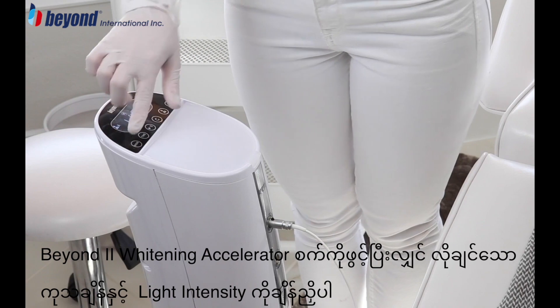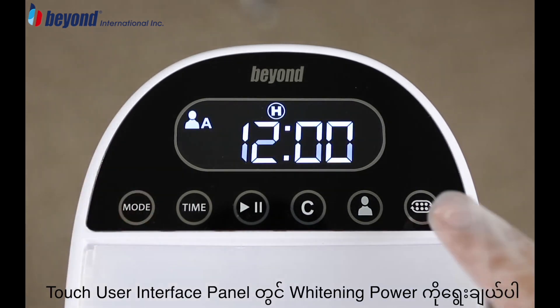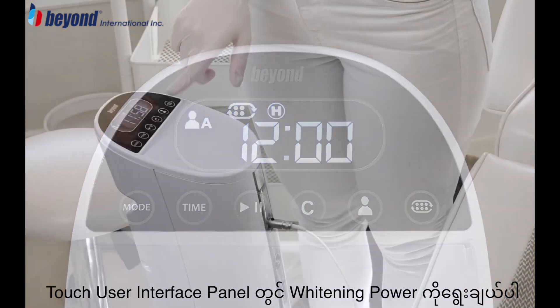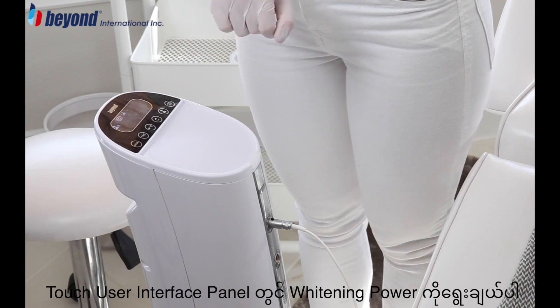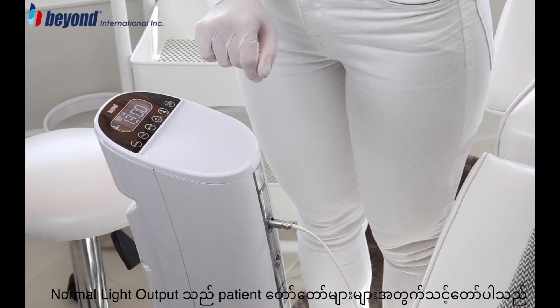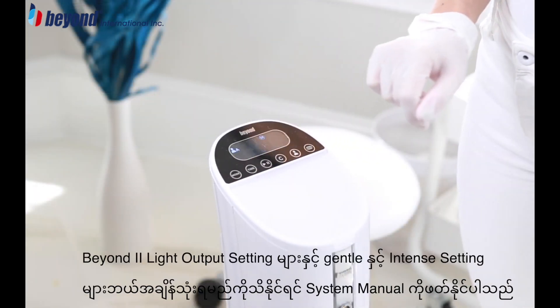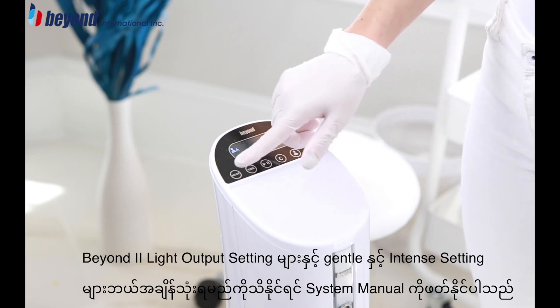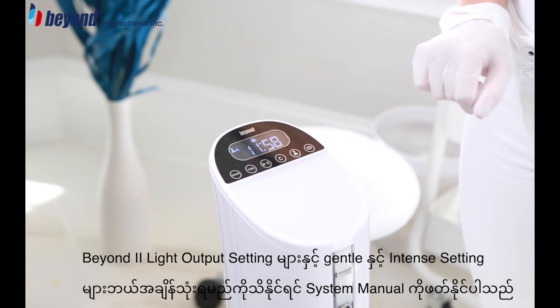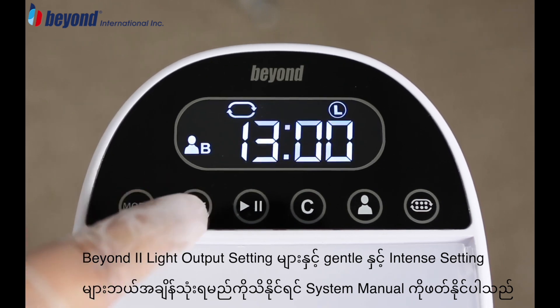Turn on the Beyond 2 Whitening Accelerator and program the desired treatment time and light intensity as discussed with the client. Select the Power Whitening option on the Touch User Interface panel and select the Normal Light Output Setting. This is the recommended light output setting for most clients. For additional information on the Beyond 2 light output settings and when to use the gentle and intense settings, refer to your system manual.